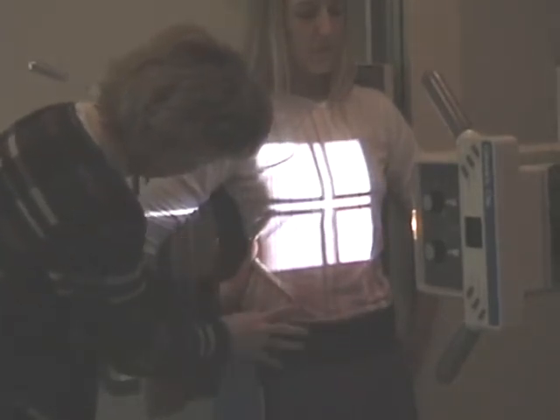We're just getting a little bit of light there. And I'm analyzing to make sure I'm getting an adequate amount of the left side ribs. And I'm happy with that positioning.